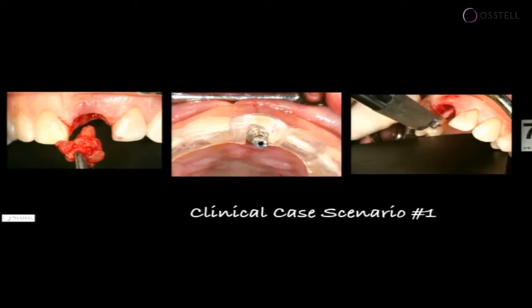Thank you. So this is what was performed for this patient. The tooth was extracted, obviously, and you can see the reactive granulation tissue that surrounds the root itself. The positioning of the implant during the implant placement or site preparation, as you can see, was aimed more towards the palatal aspect, as Dr. Ganz has pointed out, where the majority of stable bone is located.